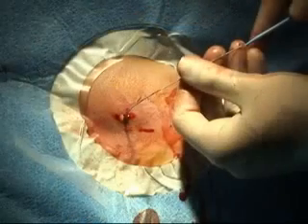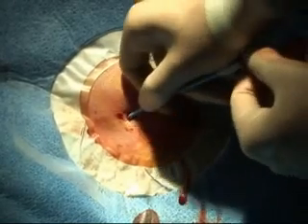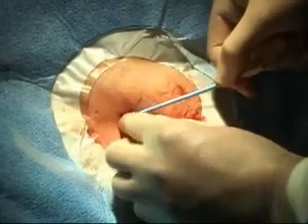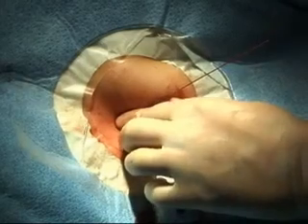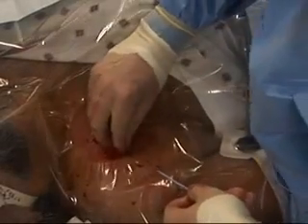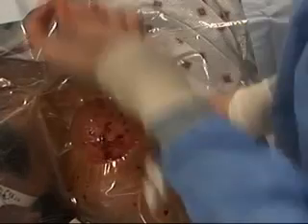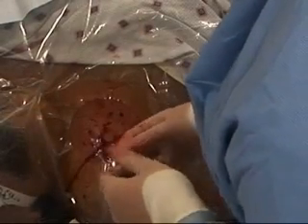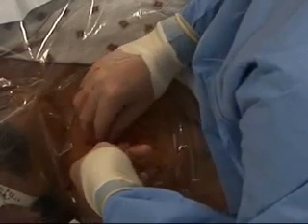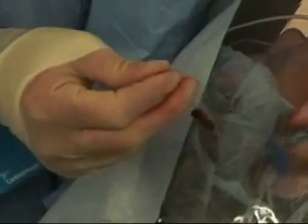Place the dilator over the guide wire, being certain to maintain control of the wire at all times in order to prevent a wire embolism, and advance the dilator one to two centimeters by holding it close to the tip and rotating it. Be careful not to introduce a bend or kink in the guide wire. Remove the dilator, anticipating increased bleeding, and maintain a grasp on the wire. A 4x4 gauze pad can be applied to the insertion site to minimize blood loss. Once only the wire remains in place, feed the catheter over the guide wire, being certain to maintain control of the external end of the wire before advancing the catheter through the skin. This usually requires that the wire be pulled slightly out of the patient until the external end extends out of the catheter hub and can be grasped. While grasping the external end of the guide wire, advance the catheter over the wire using a rotating motion.